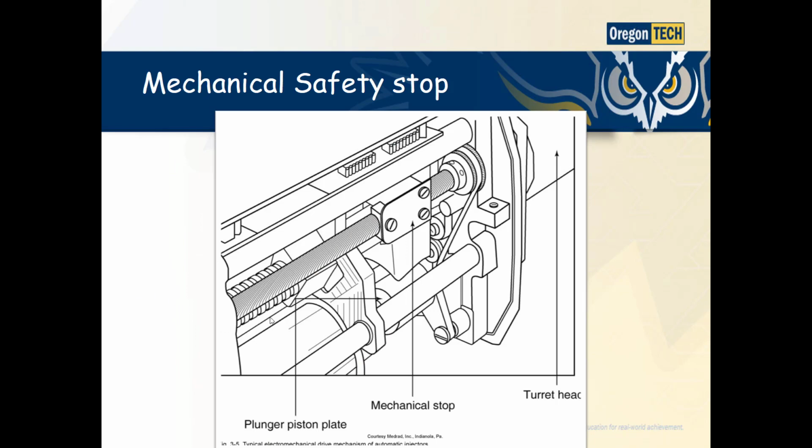And here's what I was talking about. See this right here, this is the auger screw, and this is the nut that goes on that, and then this is going to be the plunger piston right here, and it pushes the syringe out. When you set a given volume, this is going to come up into place so that you will not deliver more than, let's say you said it's going to be 40 cc's of contrast, you're not going to deliver more than that.